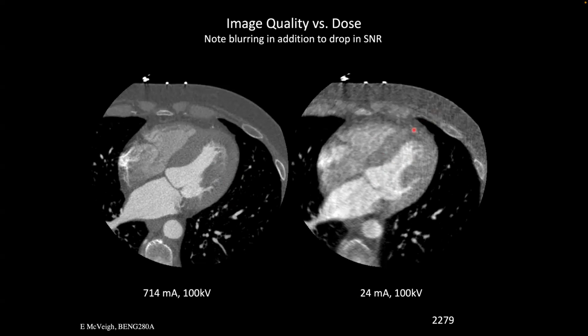So what is it adequate for? If you were looking at, does this patient have a heart that is the right basic shape and it is moving in the right way? Probably that's good enough, right? Because you have these large features. If, on the other hand, you wanted to tell me, is this vessel open, right? So that's the LAD running all the way down towards the apex of the heart. So it's a very small diameter because it's run a long way. Okay, well, let's go over and see what's over here. Oh, well, no. I'm not going to make that call, right? Because you get a whole bunch of things over here that could be a vessel. And so you just can't do that.